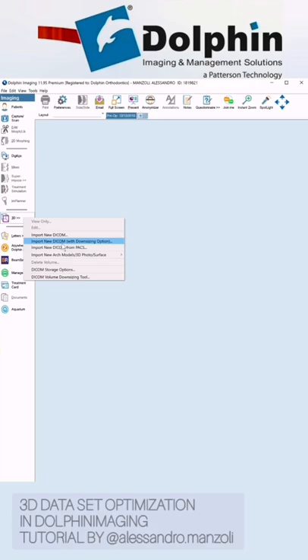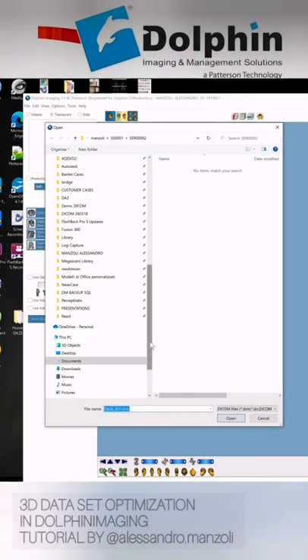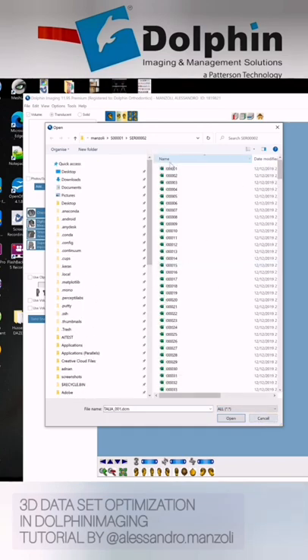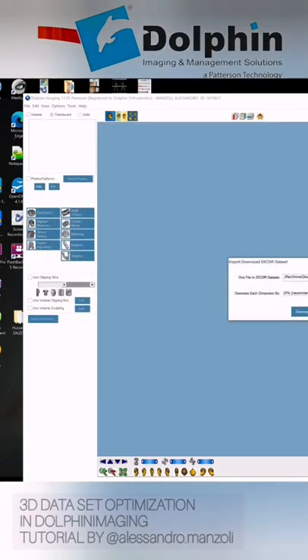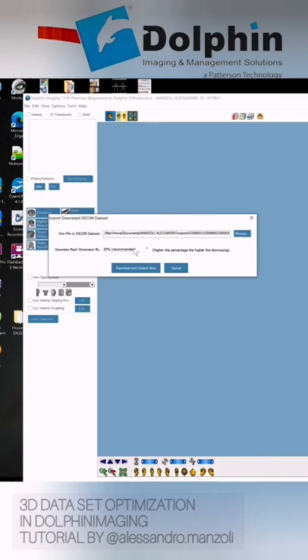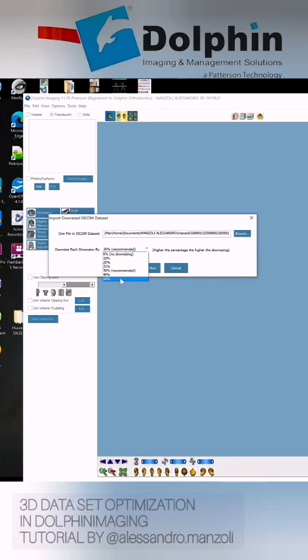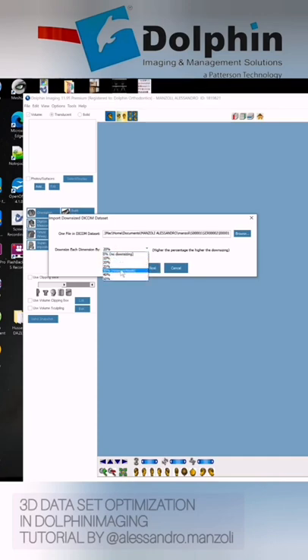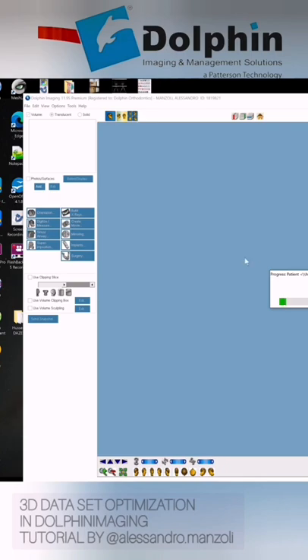So let's go to 'Import New DICOM with Downsizing' option. From here I select my DICOM file — in this case it's my own scan. I select the first file of the scan, and from here you can see I have the possibility to choose the downsizing value. So 0 is no downsizing, 50% is the maximum downsizing. The recommended downsizing is 30%, but you can try something in between, between 0 and 30. I normally choose 20. Let's go with 30% — downsize and import now. This will create a new DICOM file with a voxel size that is 30% larger than the original one.